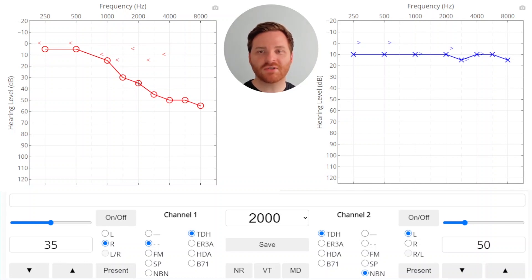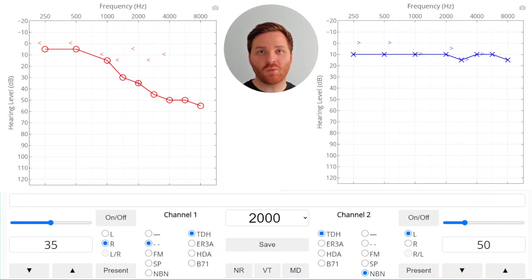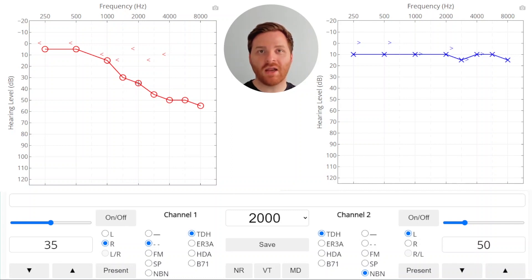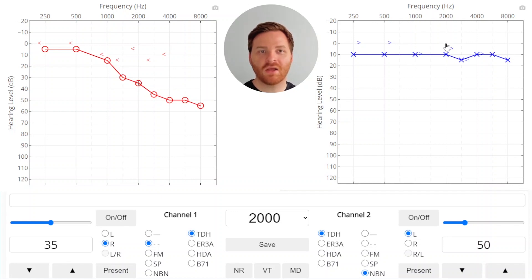We'll start at 2000 Hz. If you look at 2000 Hz, the threshold that we found without masking was 35 dB HL. Remember that a 35 dB HL sound in the right ear will lose about 40 dB as it crosses through the skull and is heard by bone conduction in the non-test ear. That means a 35 dB HL sound in the right ear is going to cross over to the left ear and be heard in the left ear at negative 5 dB HL by bone conduction.